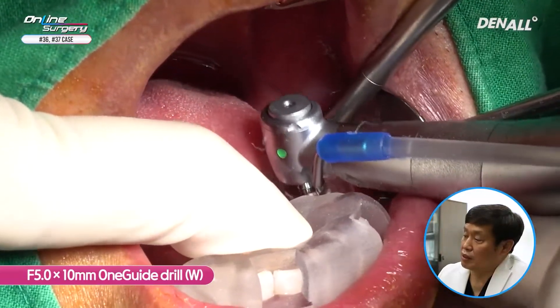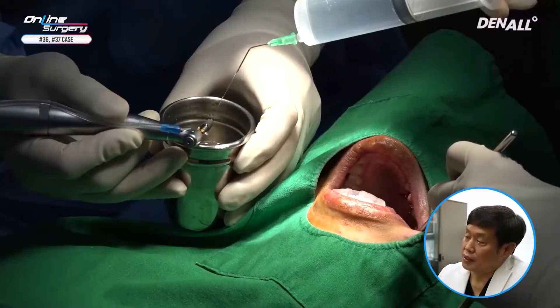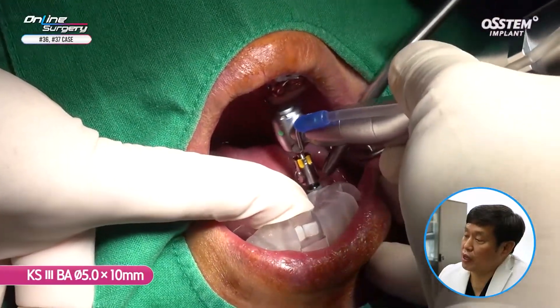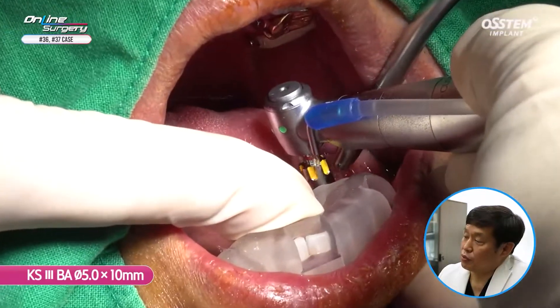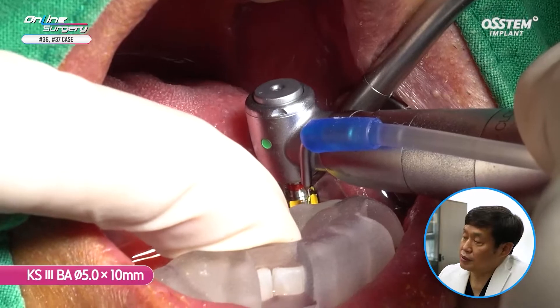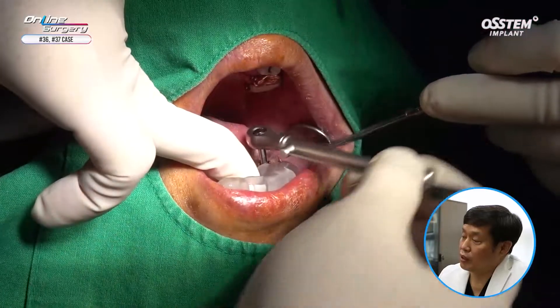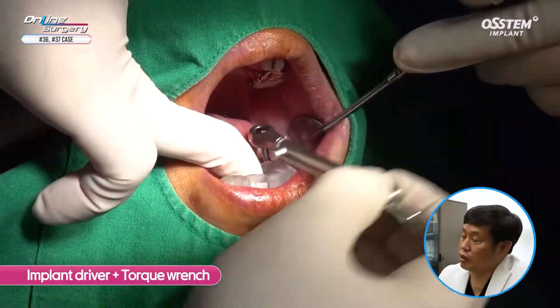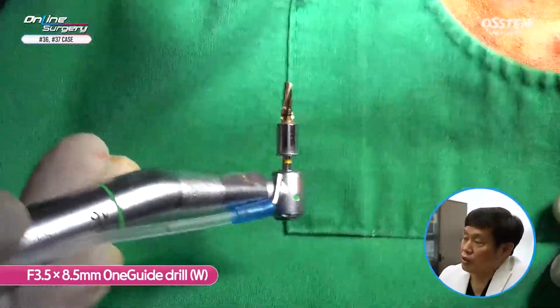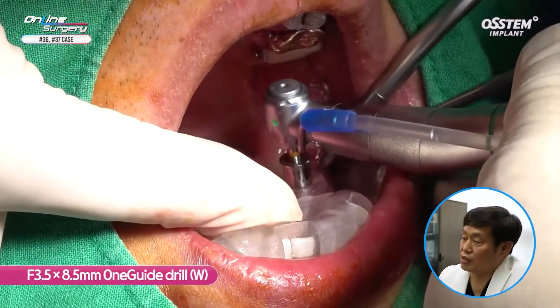I am drilling up to 5.0. After that, I'm irrigating sufficiently with saline on the KS3 BA surface implant. This is a 5.0 x 10 mm implant; I'm placing it about 80% using the engine, and then the torque wrench is used to position the implant. The primary stability is not really good — less than expected. So for number 37, I'm planning to do under-drilling.